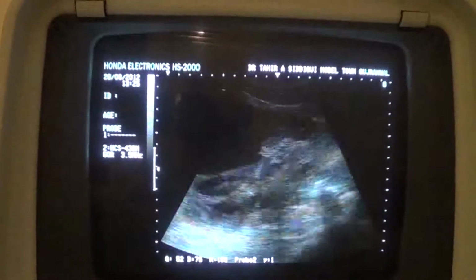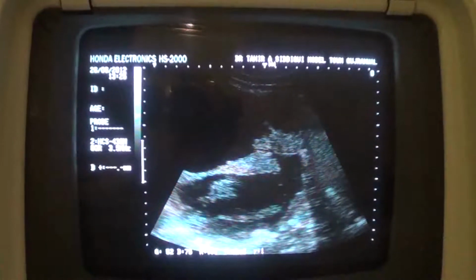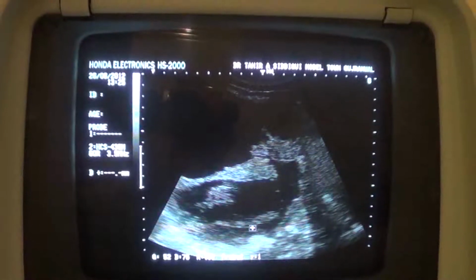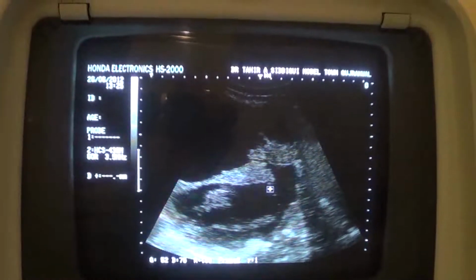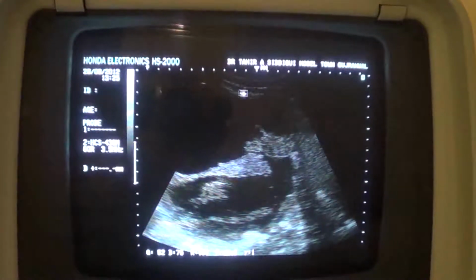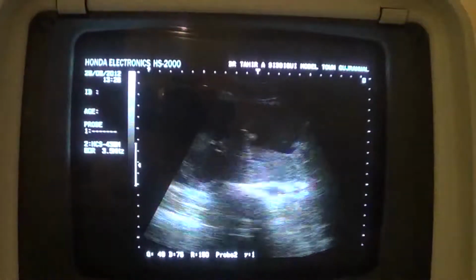These are the solid areas within this. Now you see, these are bands of echogenic areas or islands of echogenic area. This is an island of echogenic area. None of these is giving any posterior shadowing, and this is total cyst. There is no calcification within the cyst.